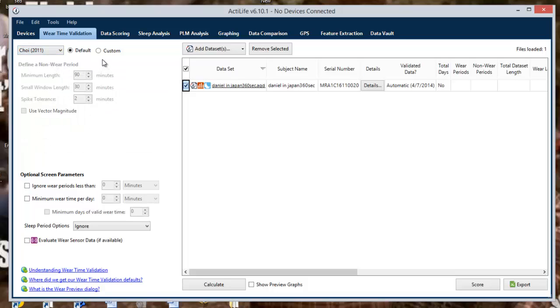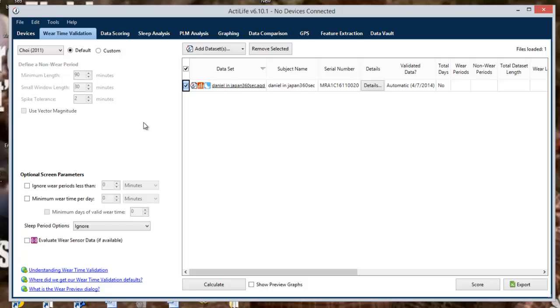You should then select the algorithm that best fits your needs. For more information on the validated algorithms and their parameters, you can view the blue hyperlinks in the bottom left hand corner. Once your algorithm is selected, you have the ability to use our default or custom setting. The custom setting will allow the individual parameters of an algorithm to be altered. For this video, we will be using the default settings.